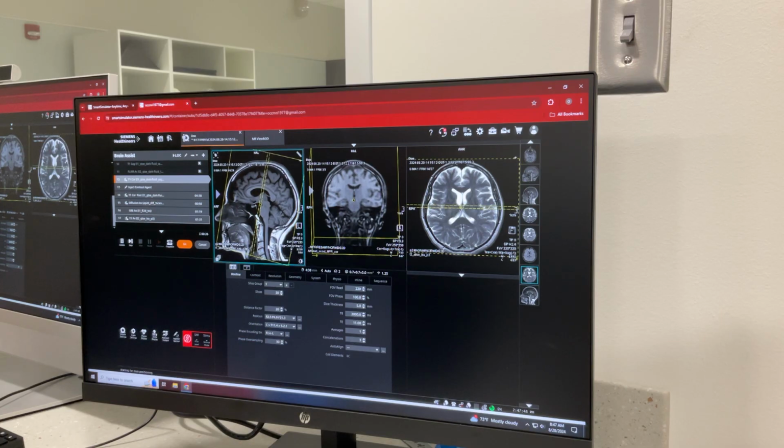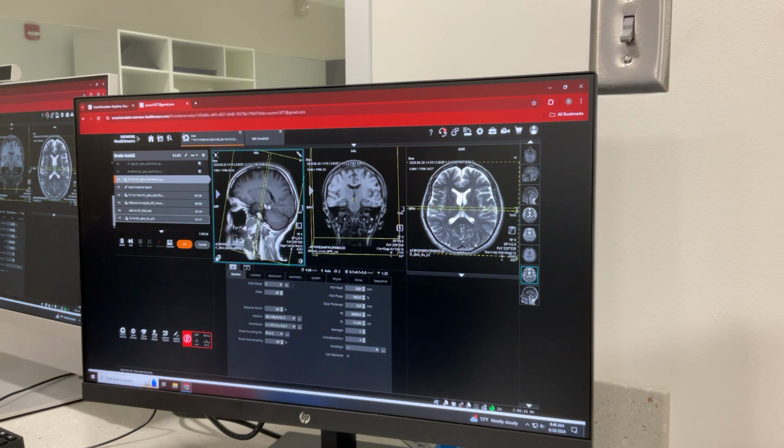And then scroll through your anatomy, because you may notice that it changes a little bit where things are at. So do you think you need to add slices, take slices away? Take a couple away. And then just scroll again and make sure you're not cutting anything out. That's good.